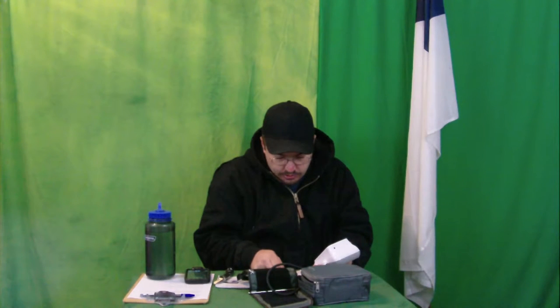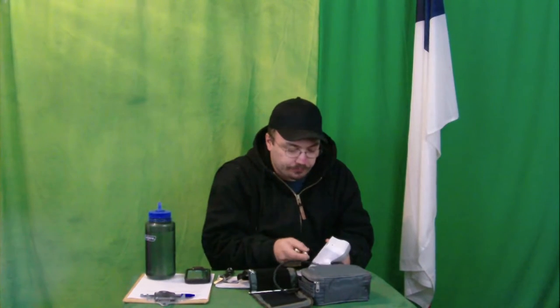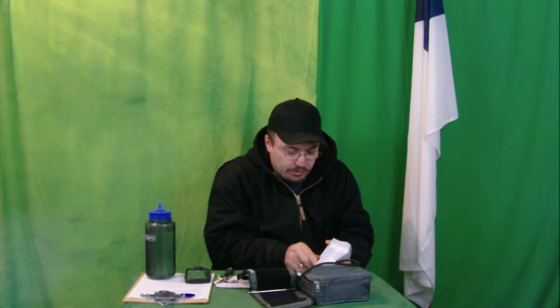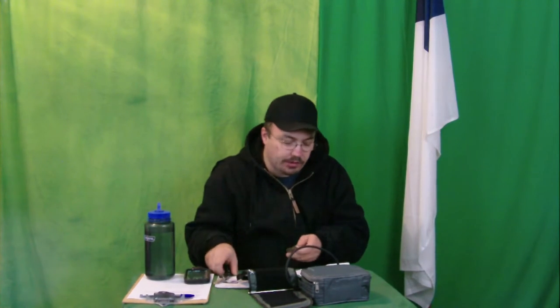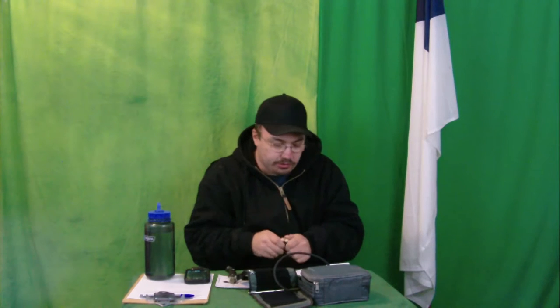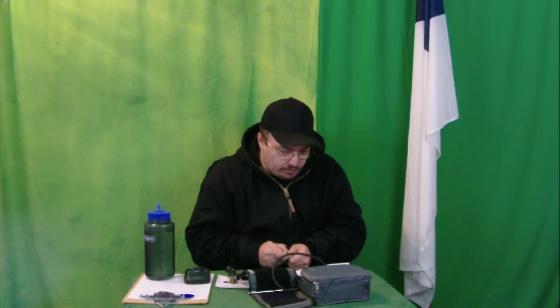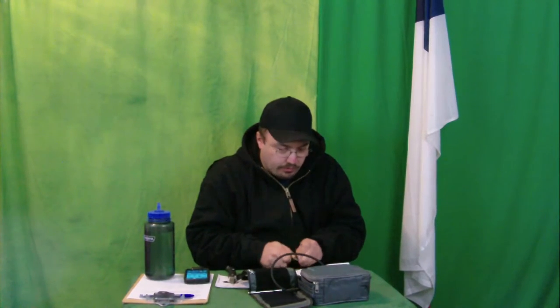We got these industrial batteries here. We're going to stick them in. And the polarity is correct with the springs, thank goodness. Some products you get from some places, the springs and the polarity of the batteries is backwards. And it actually tells you that — and it's like, why would you do that? Or there's springs on both sides. I've seen that before too.